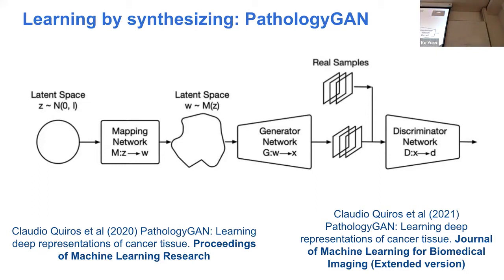I think the goal is not necessarily to learn new things. It's more about having a general representation of the image distribution. If that representation does not rely on any label, that's our goal for this entire setup. So without any label, once you're able to do that, you examine this latent space in detail and see how much useful information is there. So that's the intuition.